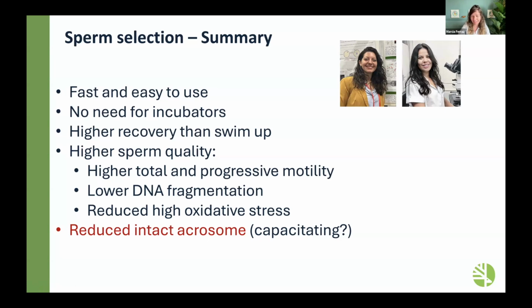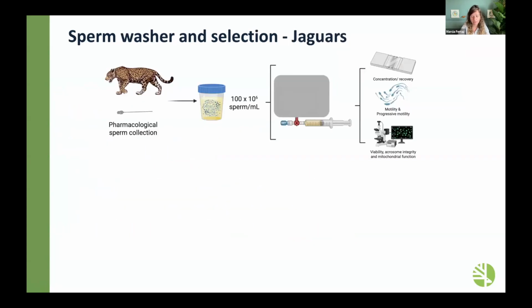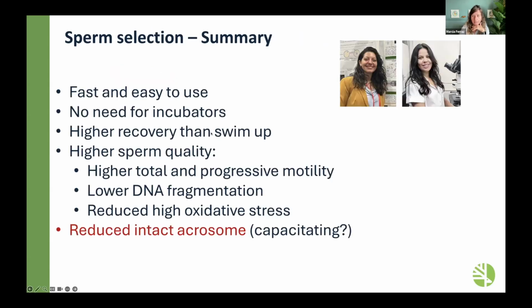So, okay, we have these two devices that seem to be easy to use and field deployable. So we decided to test them. We have collaborators in Brazil who do really nice work in jaguar conservation. So we went to Brazil this past March, testing those devices. We have jaguars that were collected by pharmacological sperm collection. I will show you what that is soon.